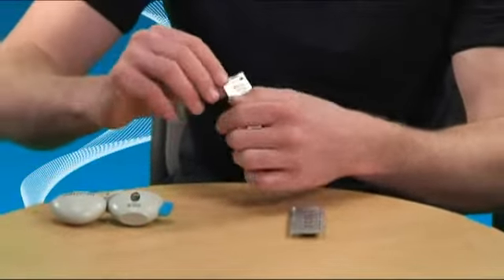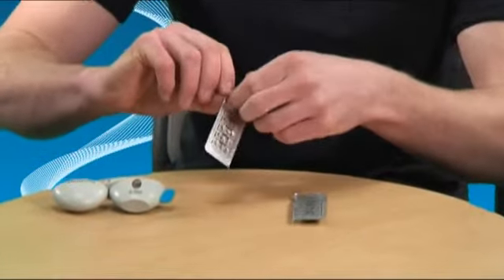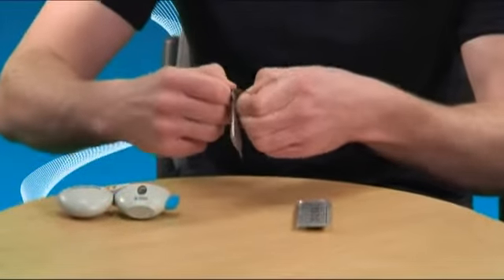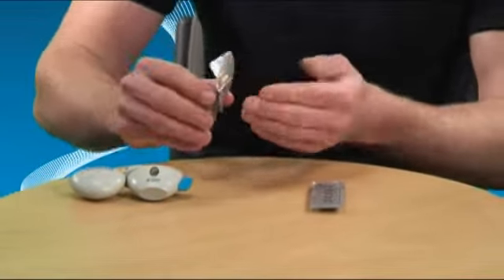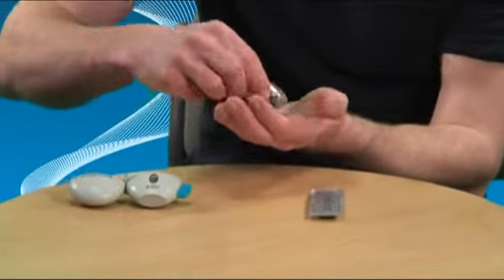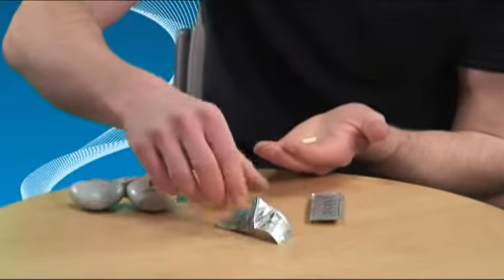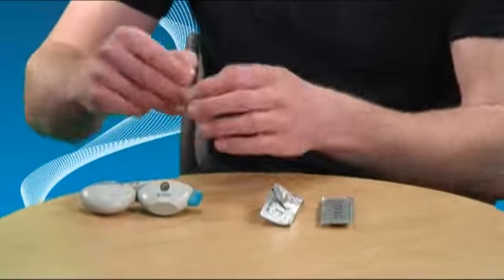Peel back the foil, exposing one capsule, and then remove it. Only open the blister immediately before you are going to use the capsule. Place the capsule in the chamber in the middle of the Handihaler.